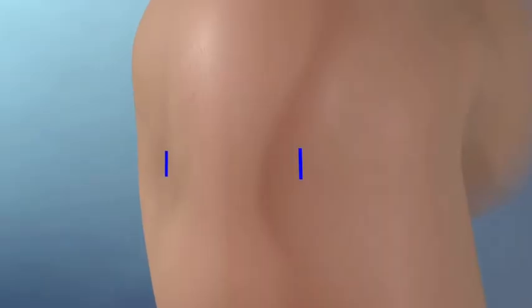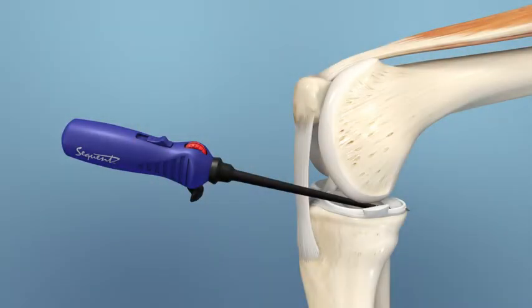Create vertical portal incisions by palpating above the joint line near the inferior pole of the patella. These incisions should be used since they allow for compensation of tibial plateau slope.